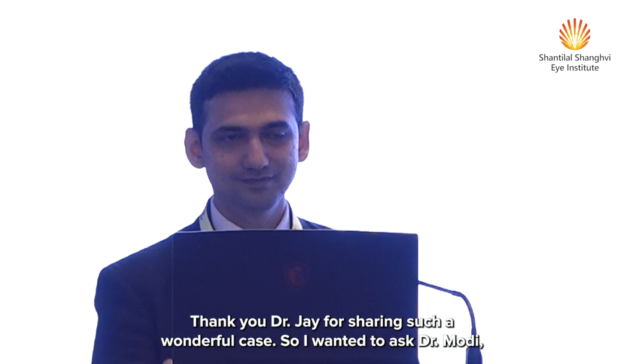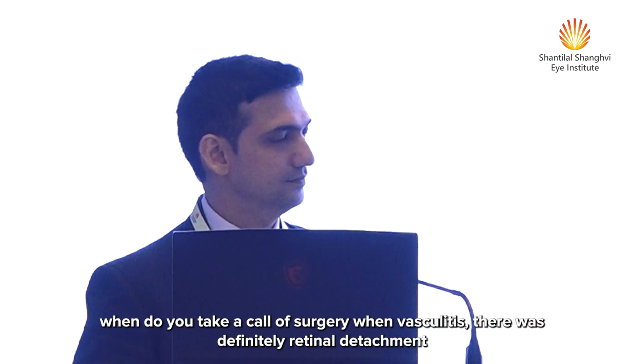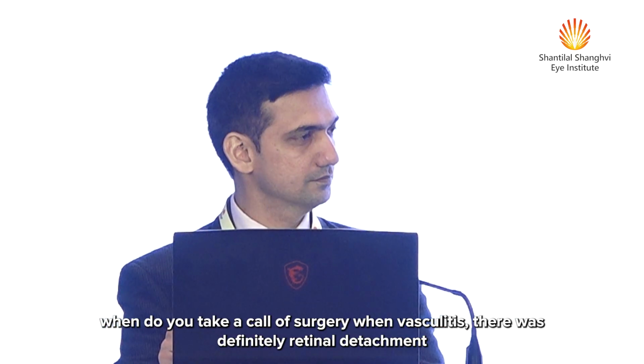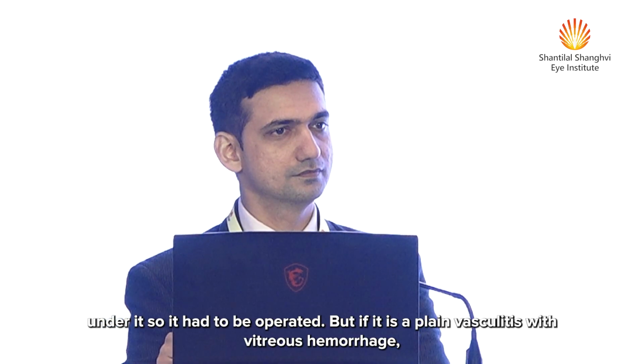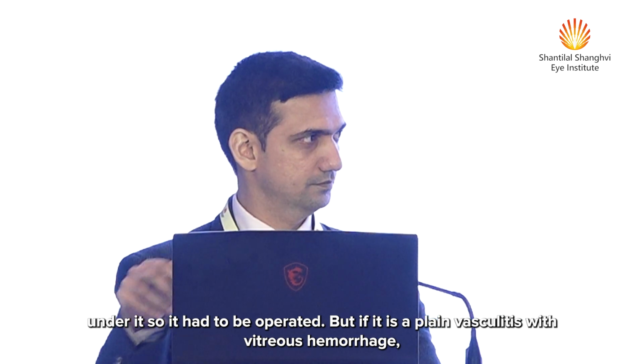Thank you, Dr. Jay, for sharing such a wonderful case. So, I wanted to ask Dr. Modi, when do you take a call for surgery in vasculitis? When there is retinal detachment, it definitely had to be operated. But if it is a plain vasculitis with vitreous hemorrhage, when do you take a call for surgery?